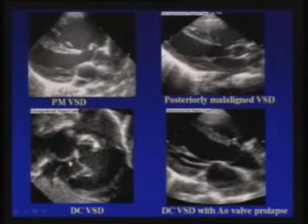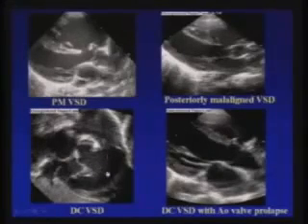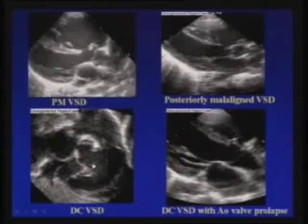This is the subcostal paracoronal view. Here what you are seeing, this is tricuspid valve, this is RV, this is right ventricle, this is aorta in short axis. This whole is a large VSD. Large VSD, dilated pulmonary arteries, and the usual perimembranous VSD extending to the outlet septum.